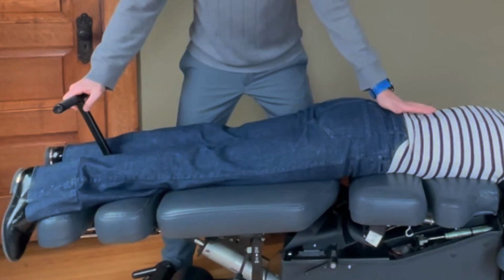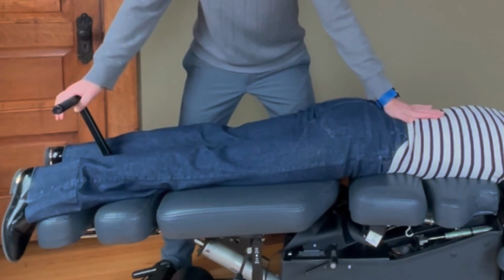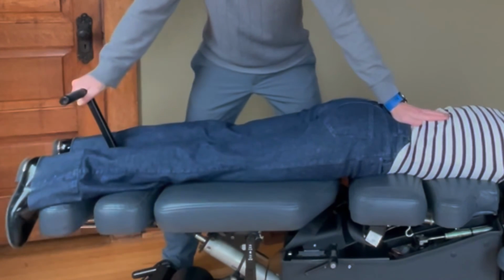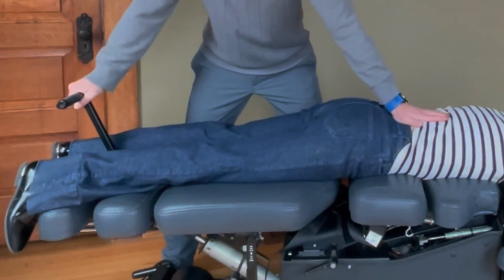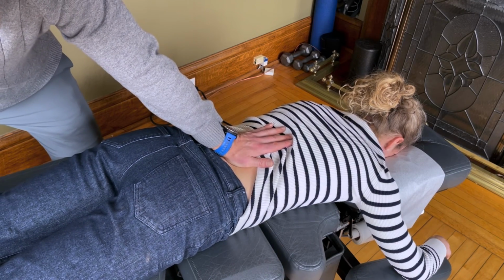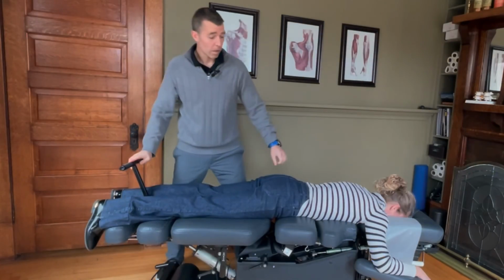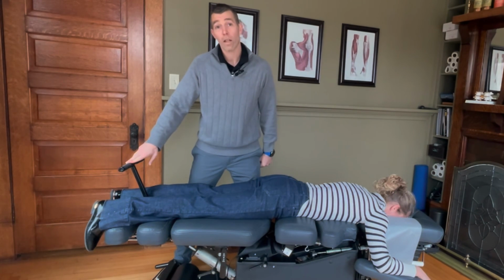So again, this is performed similar to the flexion distraction component, but as I'm going through these motions, I'm also able to assess for side to side lateral motion and the circumduction motion of the joint itself. And by doing this, we're really allowing to not only clear flexion extension, but also lateral flexion and these circumduction motions of the spine in order to try to restore full mobility to each spinal section in the lumbar spine.